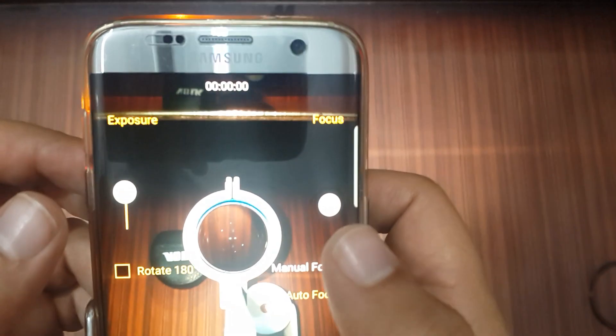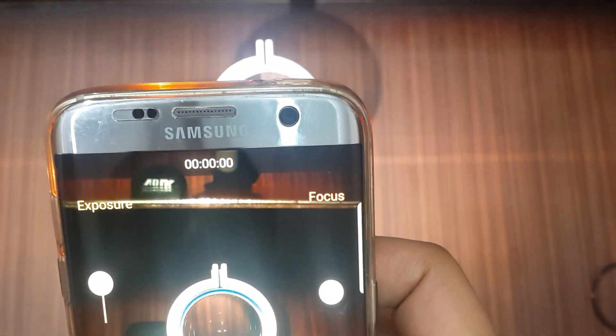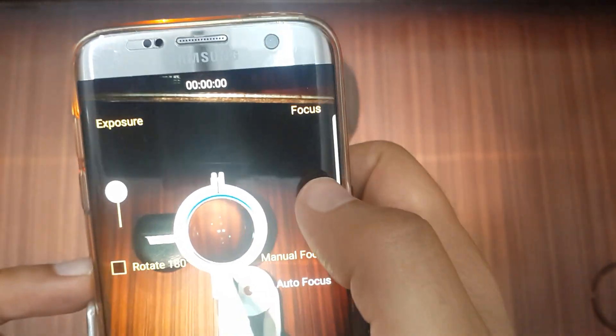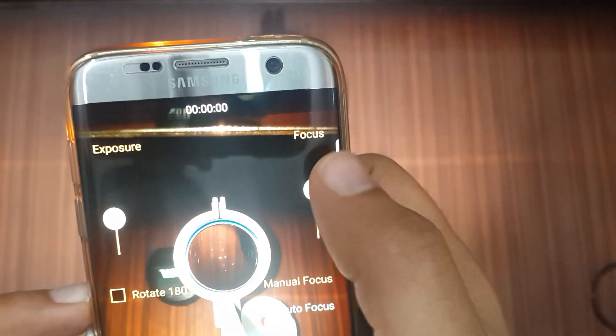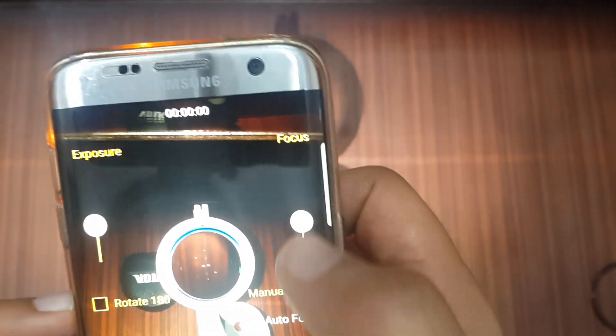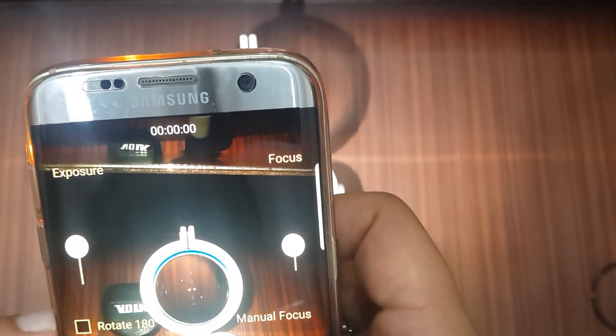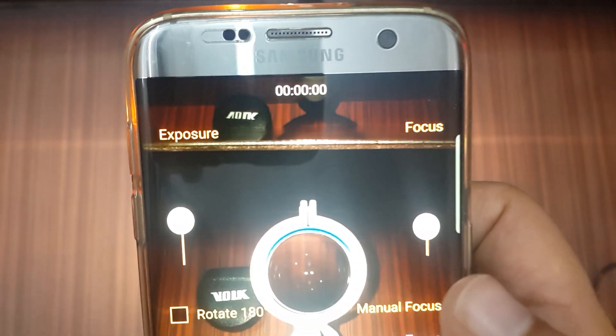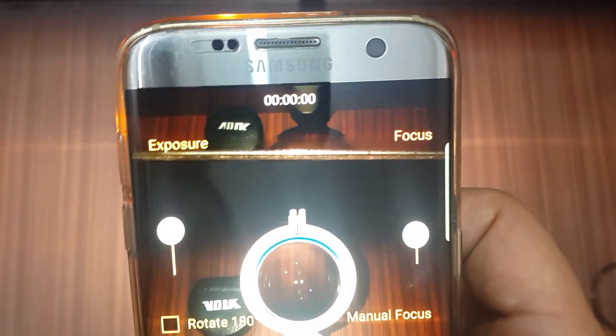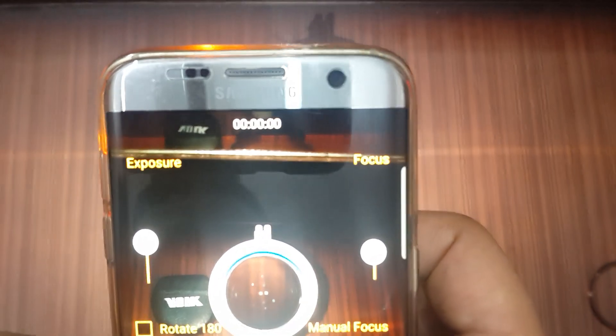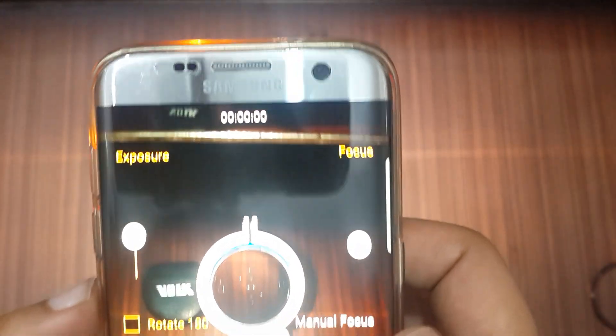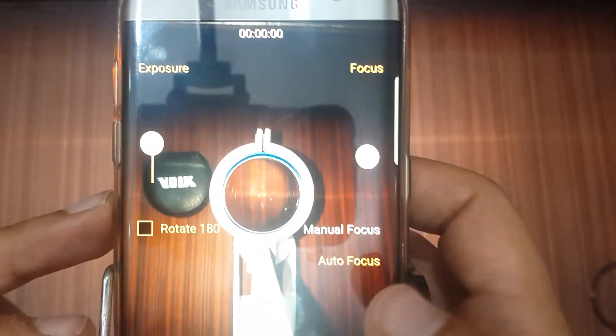Focus can be manually set in some mobile phones. Hardware enables you to use manual focus, which allows you to focus for near or far. The adjustment is set while capturing the video. I will set it to autofocus.